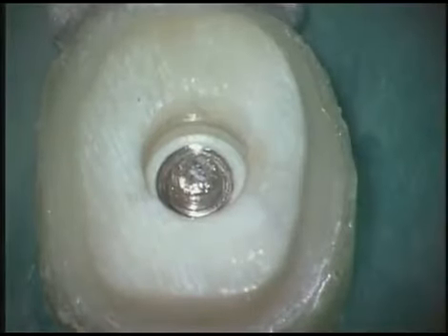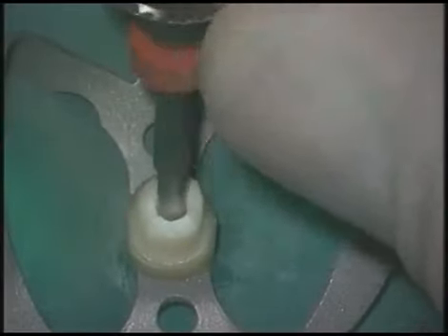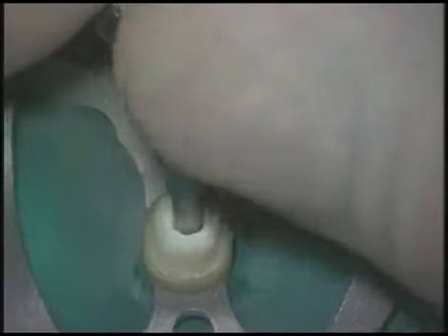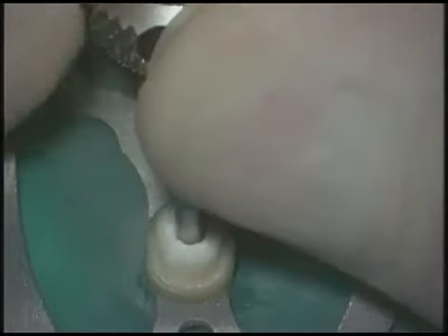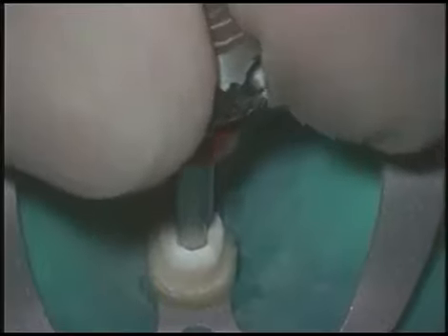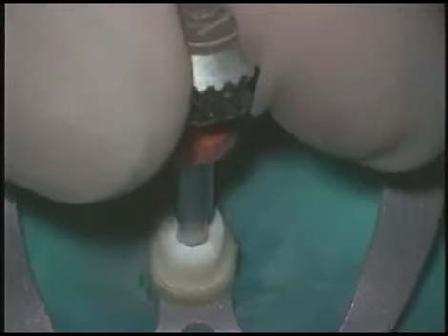The post is only machined down approximately 1 millimeter. Now the appropriately sized tubular tap is brought into place. Counter rotations, counterclockwise, begin to engage and draw the tap down. In this instance, we're probably only generating 3 or 4 threads on the post.